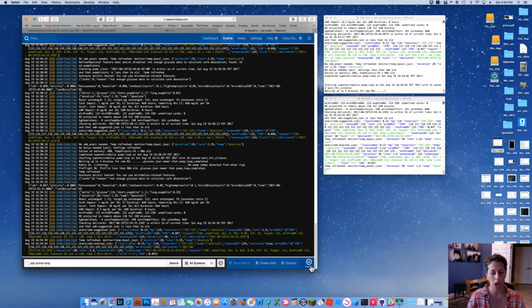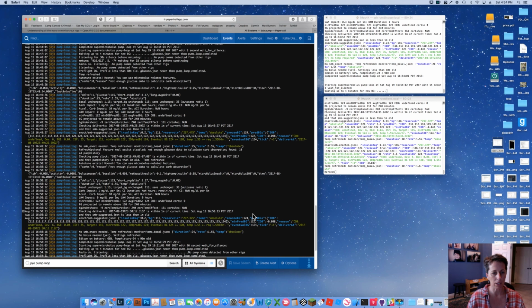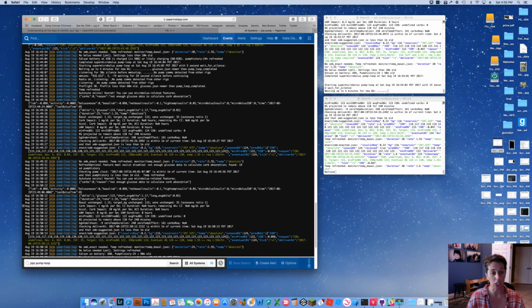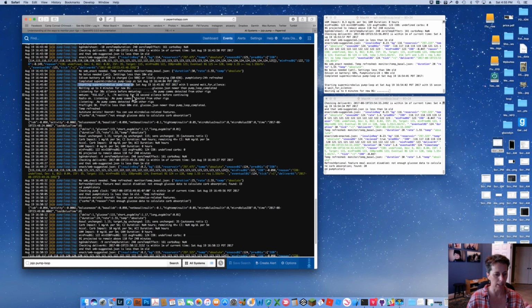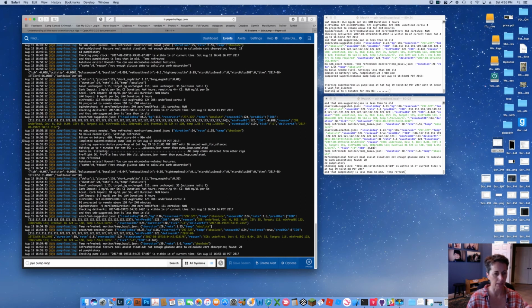So you can pause it if you want. You can pause your loop and you can go back in time and look at things. Look for something that seems unusual. Generally speaking, if you're seeing a lot of colors and you're not seeing error messages go by, it'll be really good. Your pump loop will start with a phrase that says starting super microbolus pump loop, and it ends at one that says completed, which is usually way down there, and then it'll say completed.